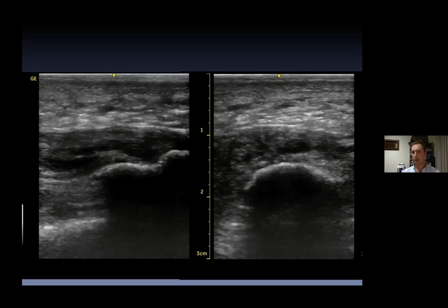In clinic, because I've got access to ultrasound, I can often do a scan and really pinpoint where I want to treat. But in most cases, really the site of maximum pain. That's why a good physical exam is important. And it's also good to mark it onto the patient before you start, because as you start treating, there's going to be a desensitization in the area. So once you start treating, the point that was maximally tender as you began treatment will no longer be tender. So then it can be harder during the treatment to find that. So it's using your anatomical knowledge and surface anatomy.